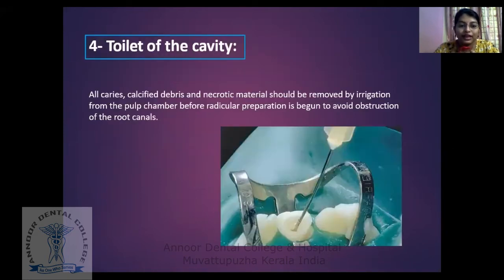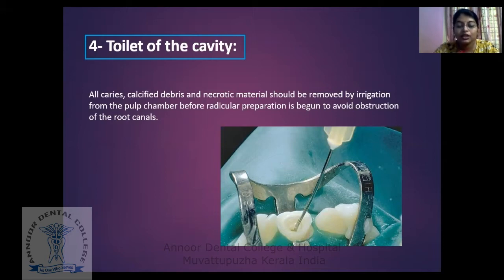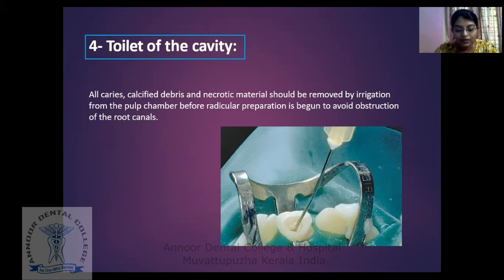Coming to the toilet of the cavity — all caries, calcified debris, and necrotic material should be removed by irrigation from the pulp chamber before radicular preparation is begun, to avoid an obstructed root canal. If there is any obstruction or calcification, we should never push it into the canal. Once the access opening is done, we have to flush it using a good irrigation method.